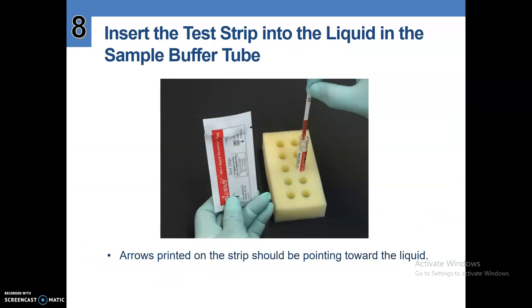Number eight, insert the test strip into the liquid in the sample buffer tube. The arrows on the strip should be pointing towards the liquid.